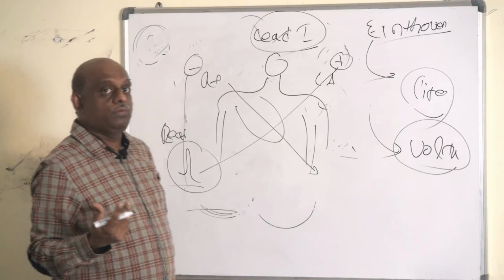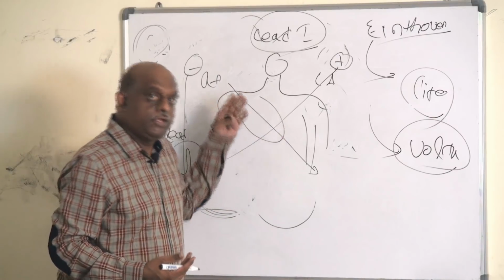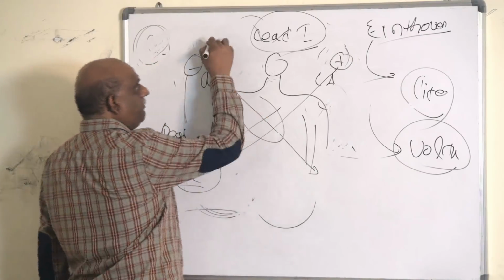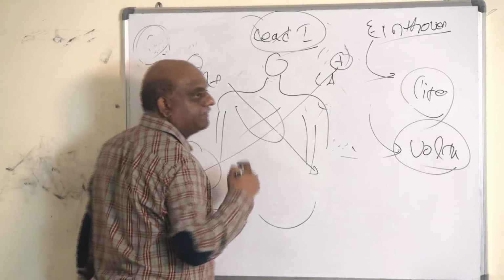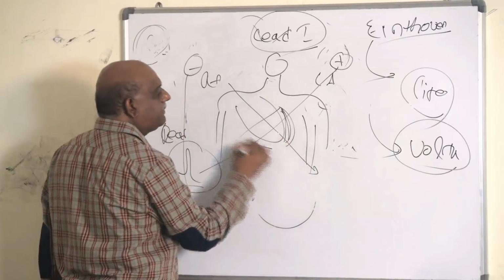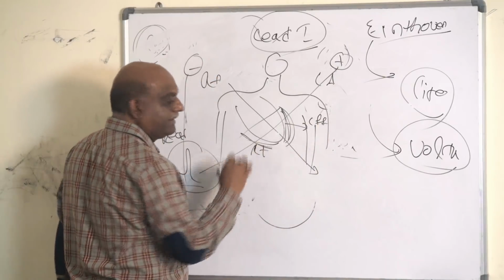So about whose axis are we talking here? We are talking about the QRS axis. Forget about P wave. P wave axis is not that important. QRS axis, electrical axis, because of the depolarization of the ventricles. Which ventricle is thicker? Left ventricle is thicker than right ventricle.